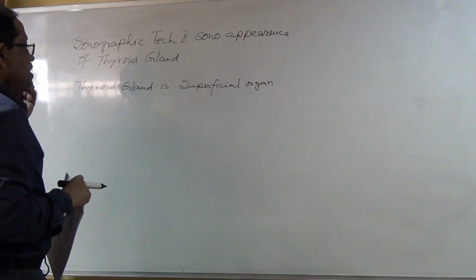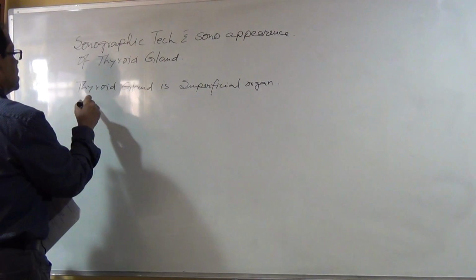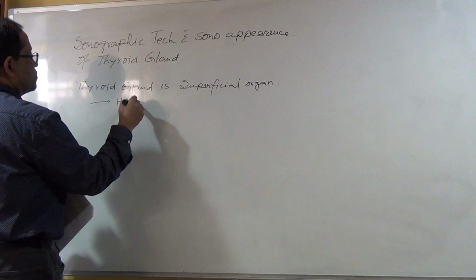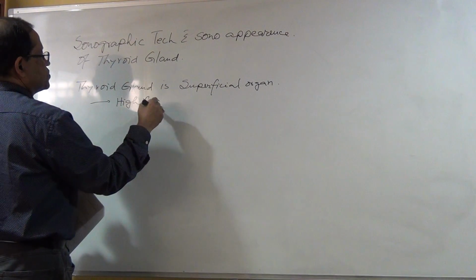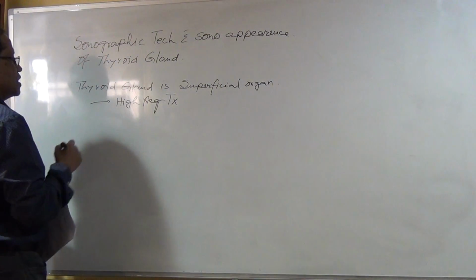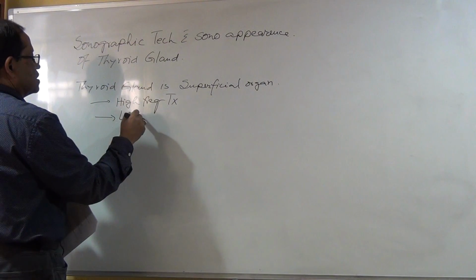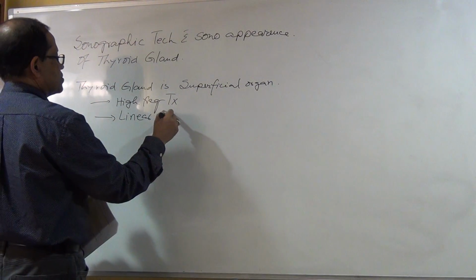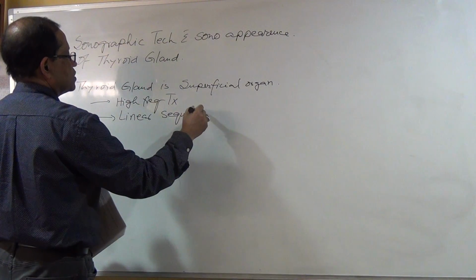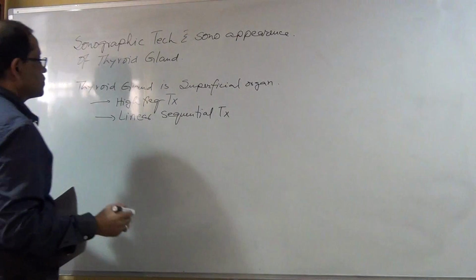And this superficial organ deserves a high frequency transducer. We use a linear sequential transducer.